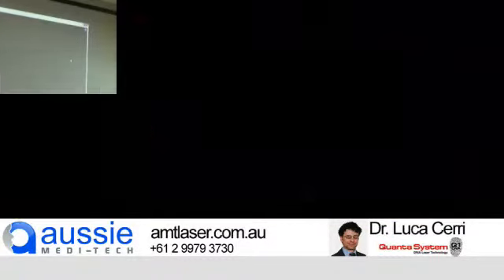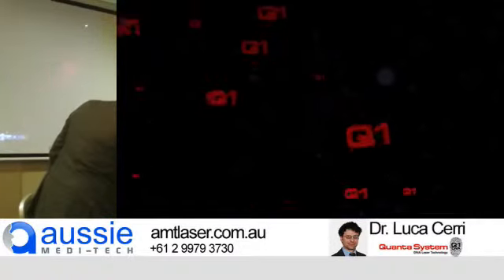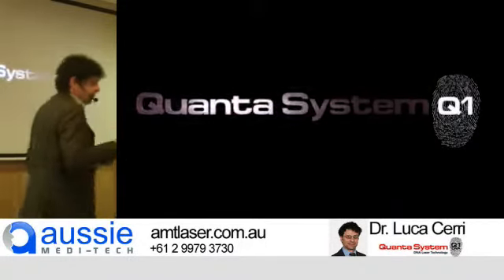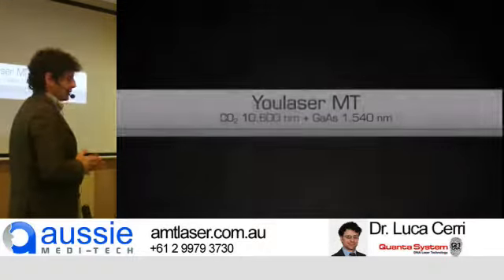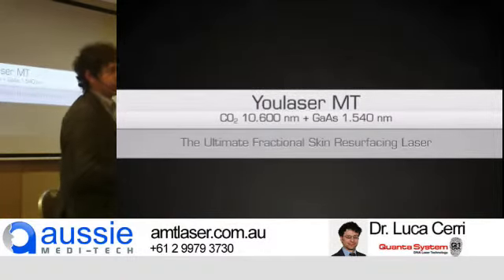At this stage, I prefer to show you a video of the product, because maybe it can be a little bit friendlier, the understanding with this as a first approach. Here. So, we can start from this, trying to stop sometimes and just explain, and then going deeper a little bit through the presentation.